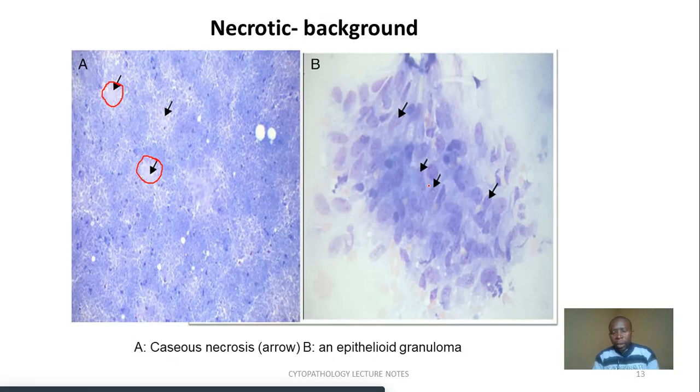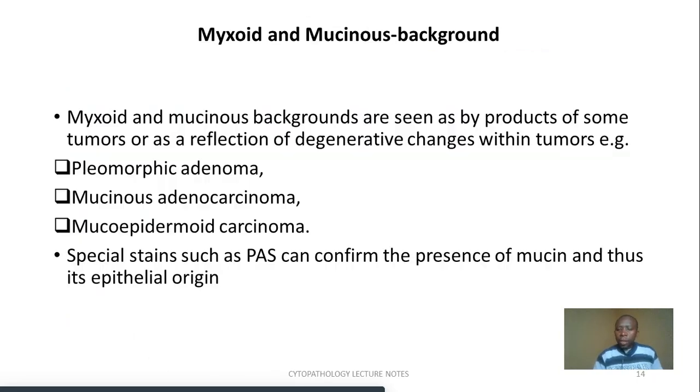And when we come to cytology, we see necrosis also appearing. We see the margin of the cells not appearing well. If we look at this area, we cannot easily identify a cell, but the cell looks to be digested or degenerated, and all these are necrotic reactions. And the background, we can see it is necrotic. If we take an example and look at this area where I'm covering, this is a necrotic background, a typical one. So this is how they appear.